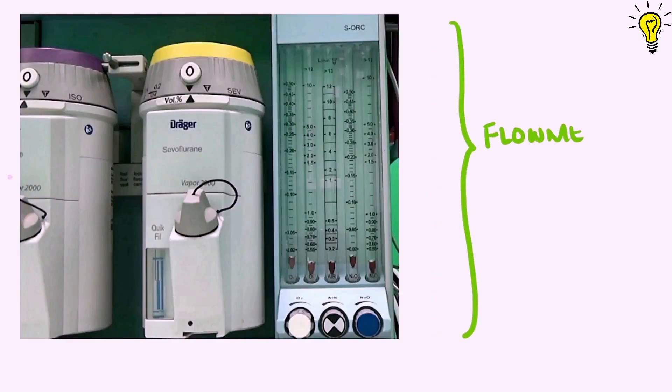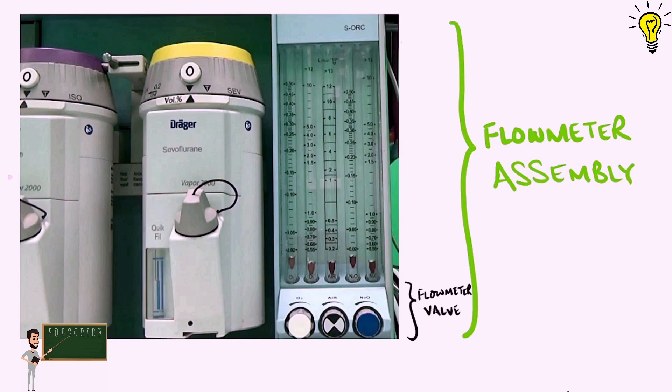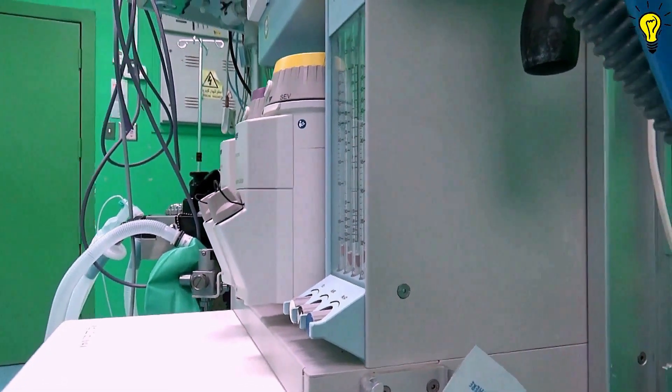The flow meter assembly has two components. The first component is invisible, the flow meter valve. And the second component is the flow meter or rotometer. So let's see the flow meter valve first.